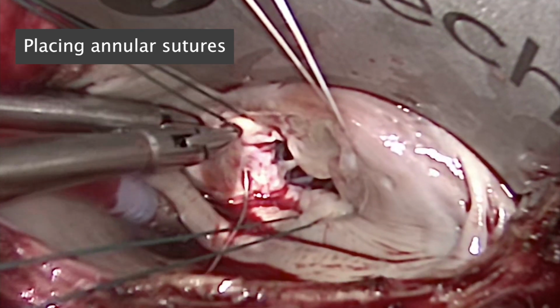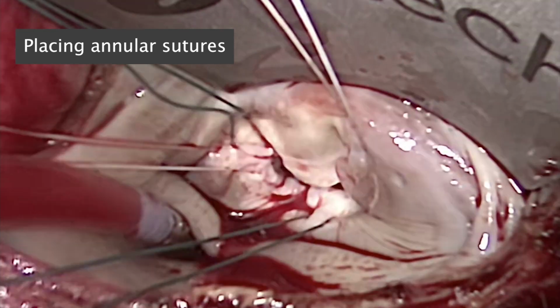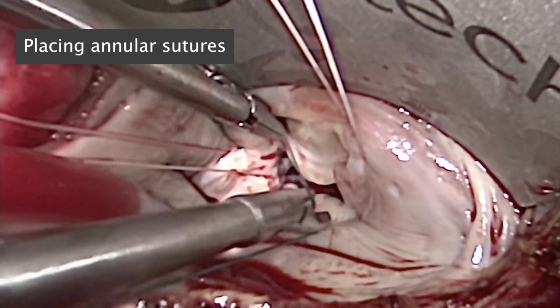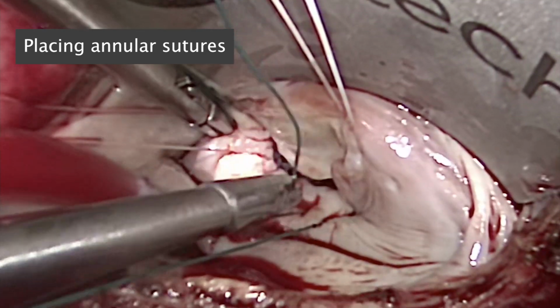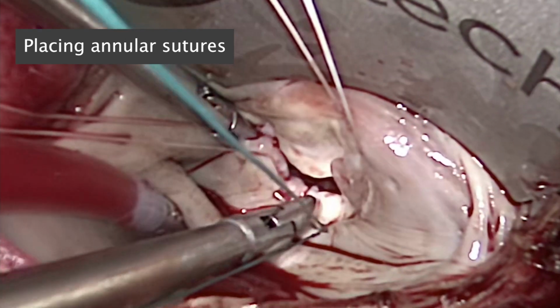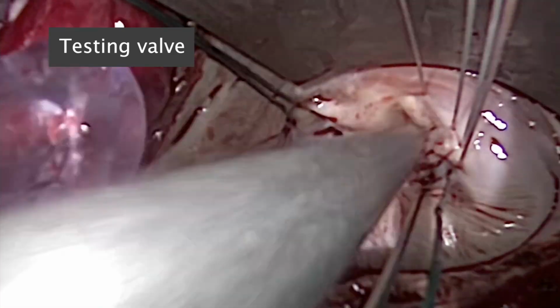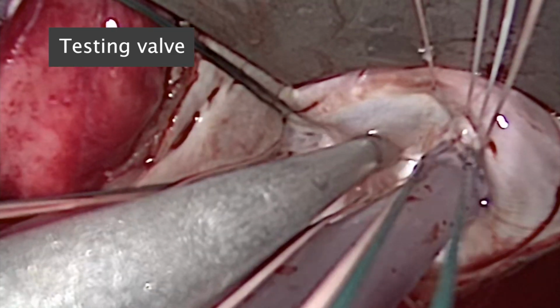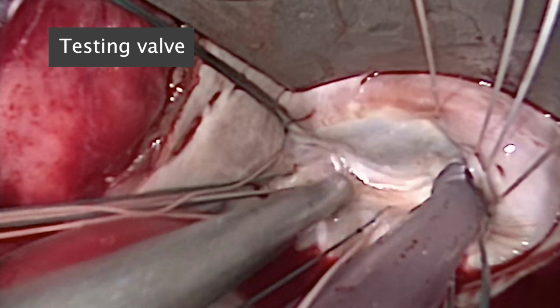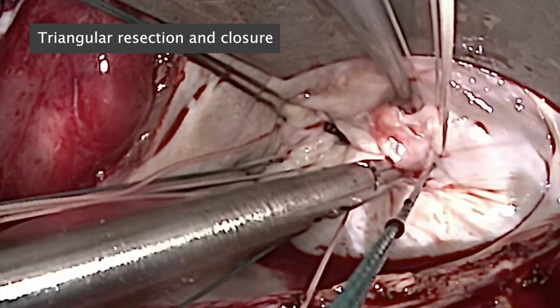Our next step is to place annular sutures to optimally expose the valve. Here we use interrupted 2-0 Ethibond sutures for this. We then test the valve and confirm the lesion is located just at P3. As you can see, there's a prolapsing segment with vegetation on it as well as a perforation.